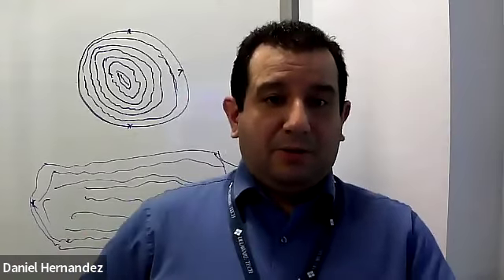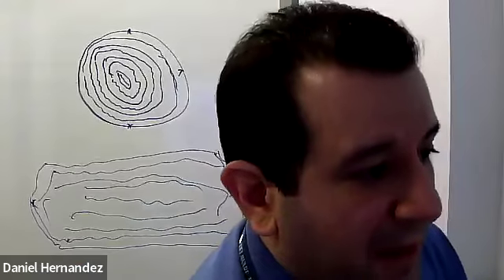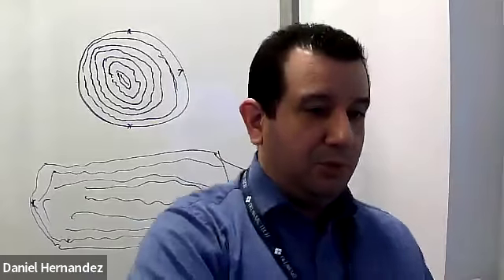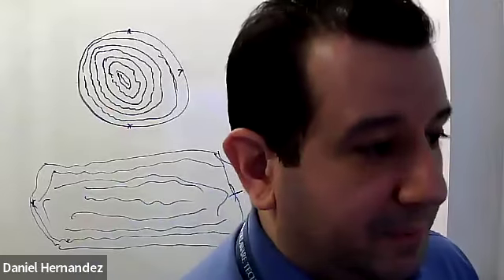So we first do the exam supine, and then we could potentially do a right lateral decubitus, so we turn the baby towards you a little bit. That's going to help shift the stomach and the pylorus more towards the patient's right, the infant's right. And maybe we can utilize the liver now as a nice acoustic window to try and see what we need to see.